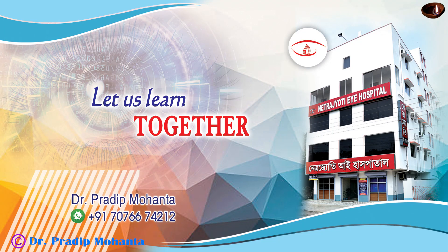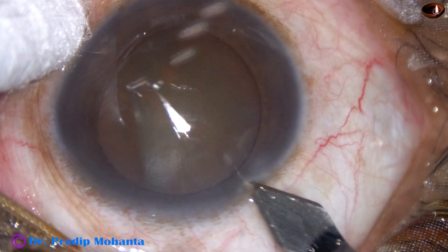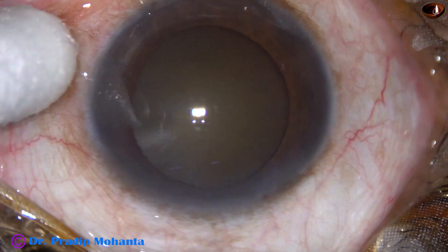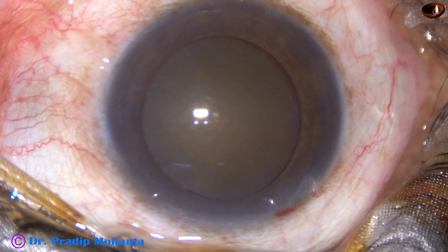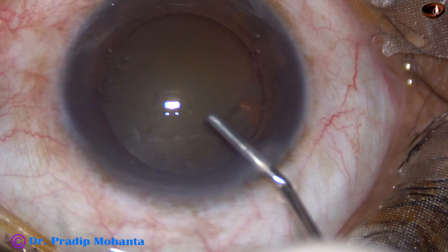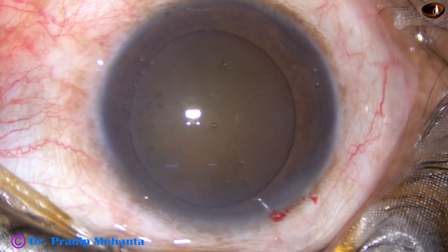Friends, in this video we are going to observe management of a hard cataract with IFIS. At this moment we can see that the pupil is quite nicely dilated. The cataract is a brown hard cataract, maybe grade four nuclear sclerosis.